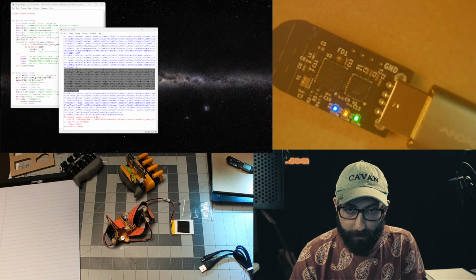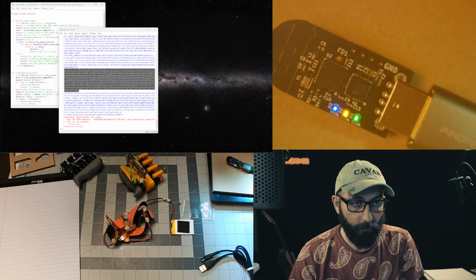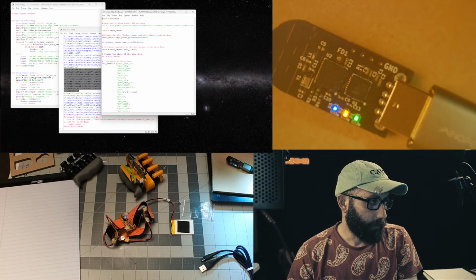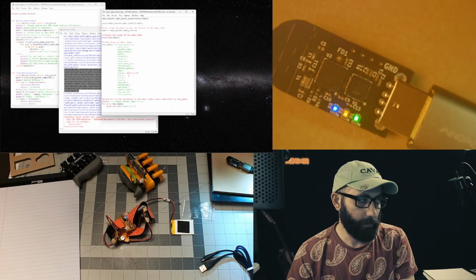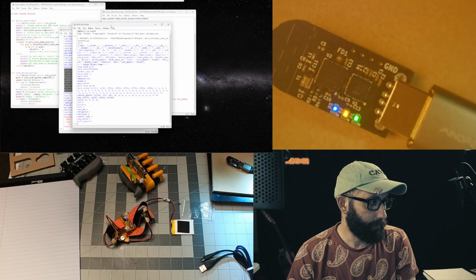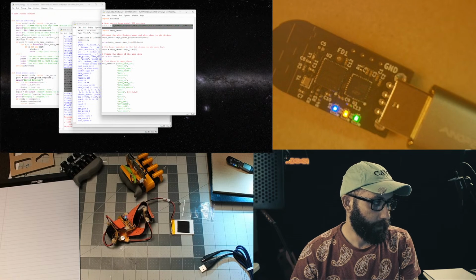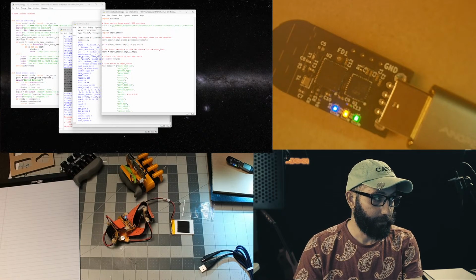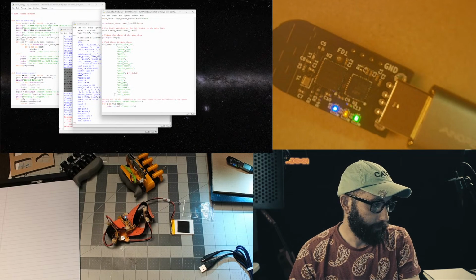So this simple test is going to help us to see if our code filter is going to work. Because we're going to need to filter these packets based off of their timestamp to match them up with the label data. Okay, so let me just run this module. Perfect. It tells us the packet contents. I'm just going to say data2 with 2 A's equals the new string. I'm going to save that.